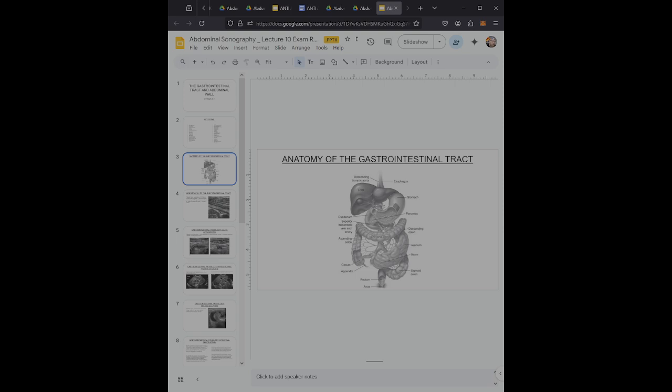The ileum meets the cecum, or the proximal colon, at the ileocecal valve within the right lower quadrant of the abdomen, and at this level there's a blind-ended tube. We know this as the vermiform appendix, and it is connected to the cecum. After the cecum, the colon is termed the ascending colon, and it travels superiorly towards the liver within the right side of the abdomen. A bend in the colon, the hepatic flexure, or the right colic flexure, marks the beginning of the transverse colon.